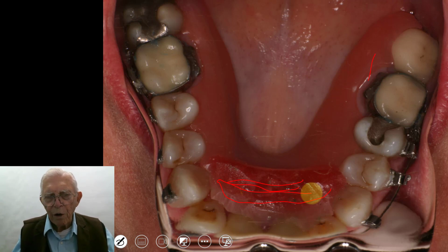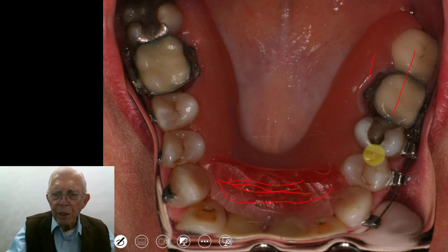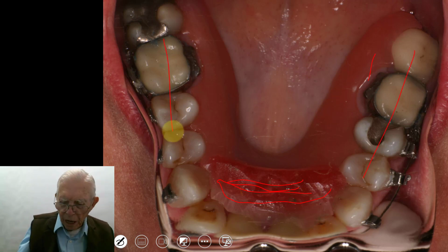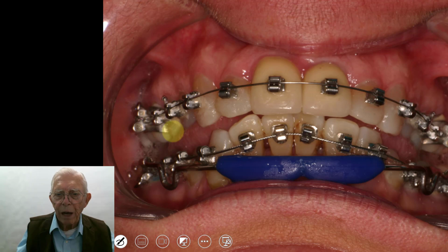They can't wear it too much because it puts all the weight on the jaw joints back here, and the teeth in the anterior part. So you can wear it some, and sleep in it or use it. And then the lower anterior teeth, where these teeth come back in contact again. And now we're going to continue to go down as we expand this back.